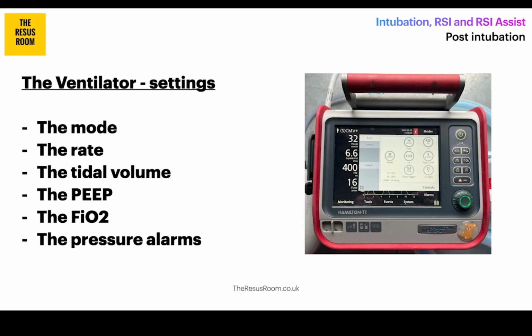Well, on ITU, there are lots of different strategies that can be used, but for our patients, well, they've just received an RSI, so they will not be making any respiratory effort at all, and this means the ventilator will be doing it all. Something you will hear called CMV, or controlled mechanical ventilation. Now, there are two different ways of controlling that, one volume controlled and one pressure controlled.